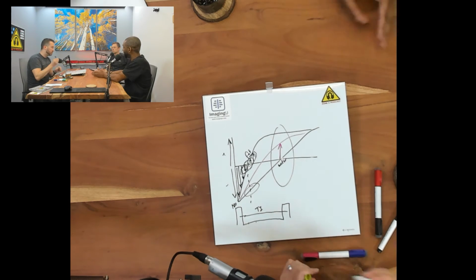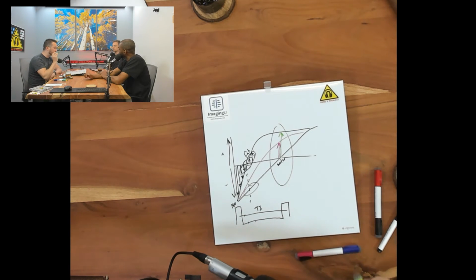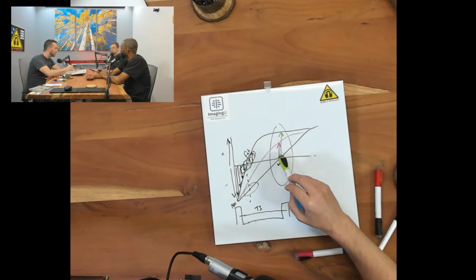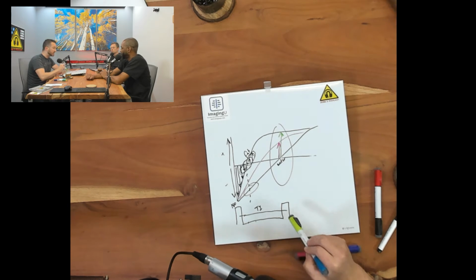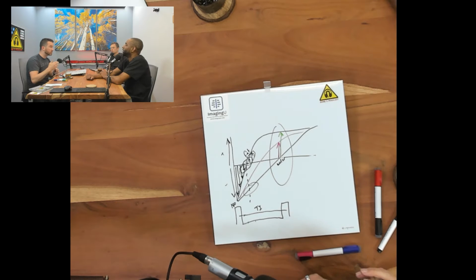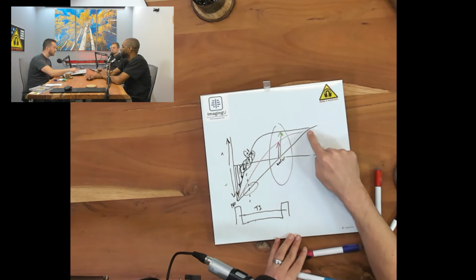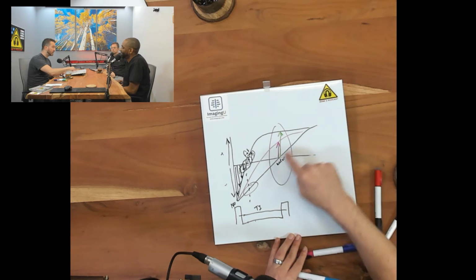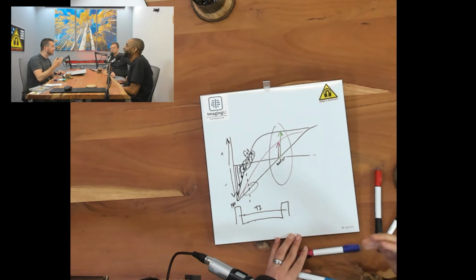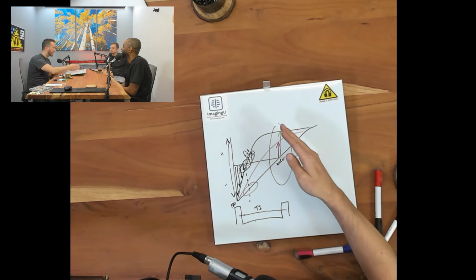So that's why the TR and the TI play such a big role with each other? Exactly. We have to choose a TI, and that determines the amount of time and what type of tissue gets to be excited. But let's say we hit water right here at zero. The reason your TR is so long on the FLAIR is that if we immediately read out and excited again, water hasn't had a chance to continue to recover. So with that next 180, it would not be fully inverted. We can't manipulate it. Meanwhile, we can manipulate all of, let's say, myocardium and fat in this case.